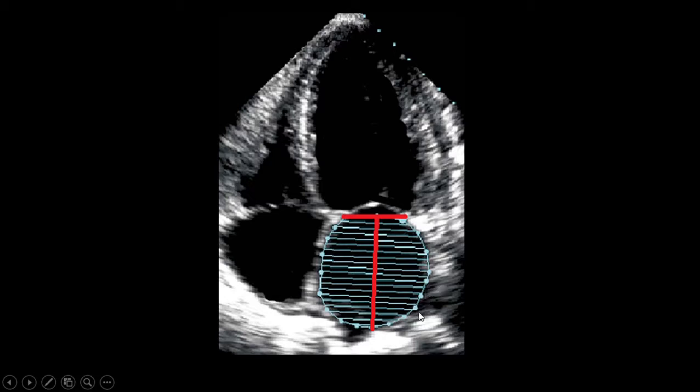Another one, as I mentioned here, you will see the thoracic aorta. Sometimes because of the angle of the sound, maybe you don't see the border between the aorta and the left atrium wall. In that case, don't go in here. Just follow an imaginary line from the lateral annulus and the part of the posterior atrial wall that is clear, and make a nice curve or line at that side, almost similar to the interatrial wall at this left side.